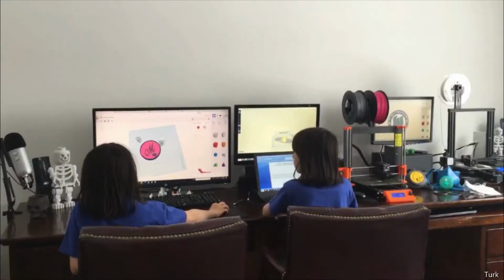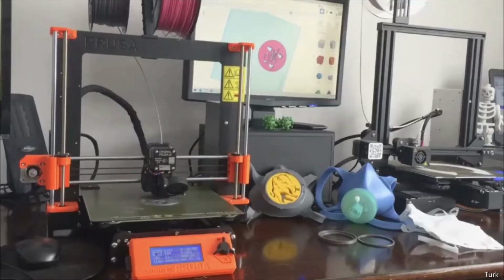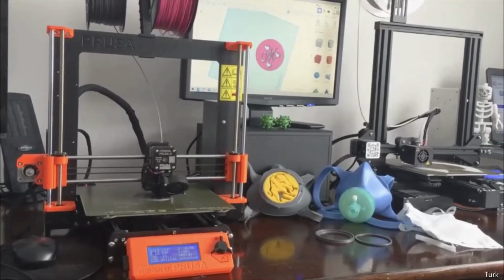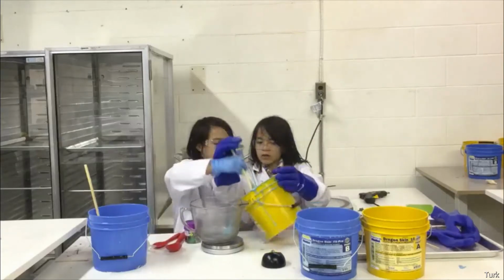For our project, we each made 2 filter prototypes. One has a plain open filter and another has a custom design. We then printed them out on our 3D printer. To make the mask, we 3D printed the molds.